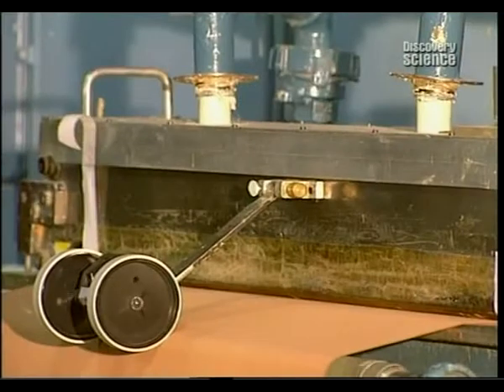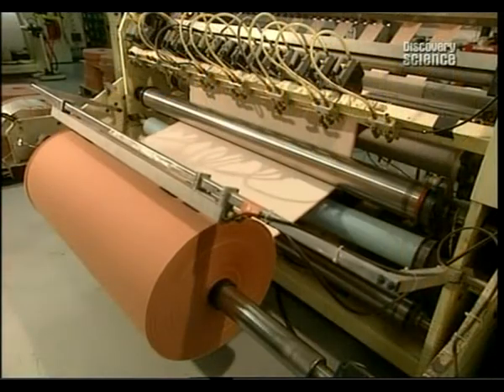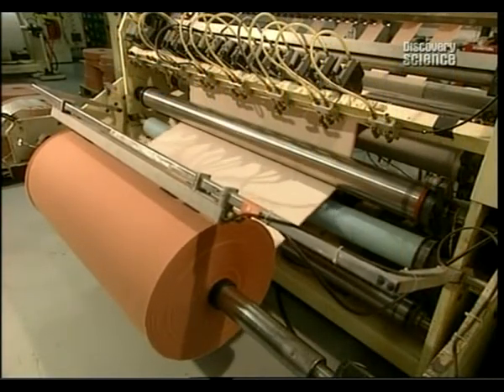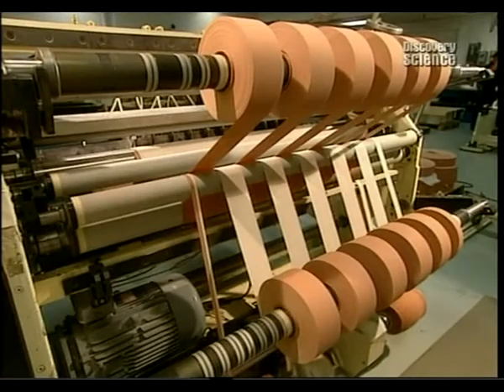A thin coating of glue is applied to one surface of the fabric. Then it's heated to 49 degrees centigrade in an oven to puff it up, creating holes in the glue coating. Then the fabric is neatly rolled up into 300 metre lengths.